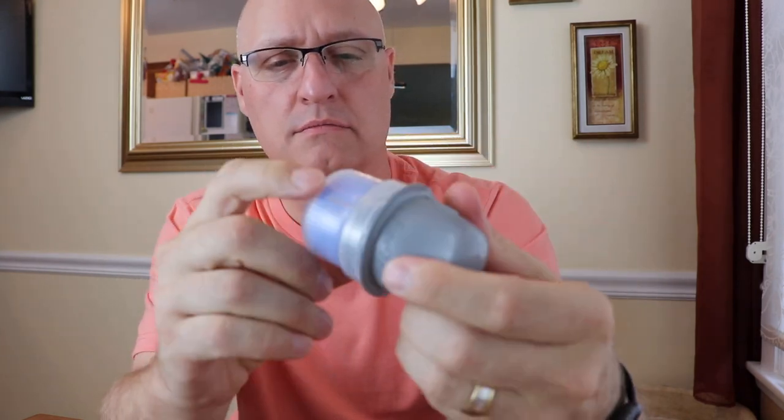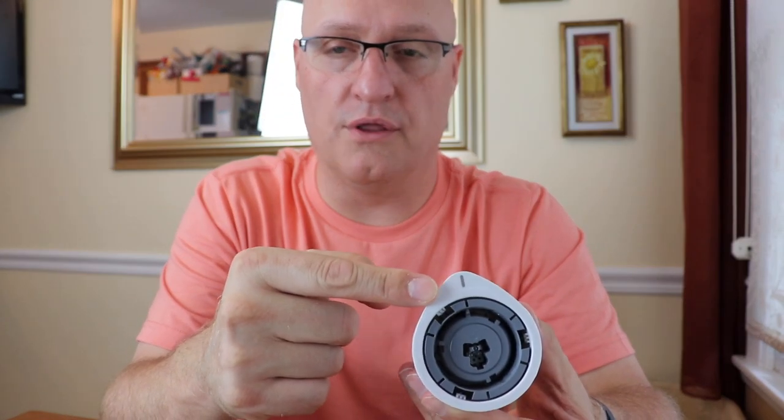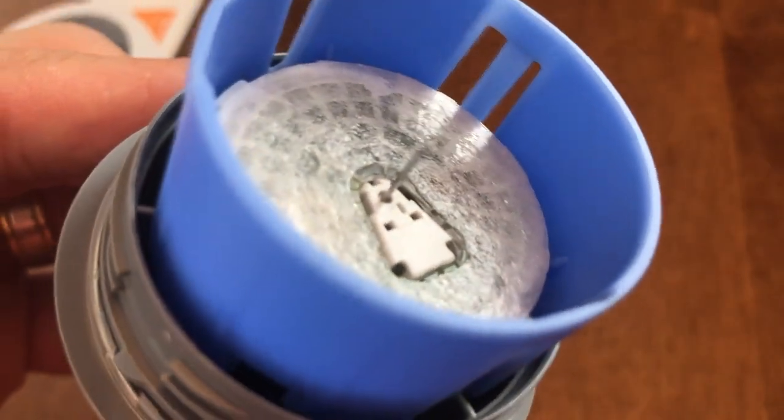I'm just going to screw this back in and put that to the side while I show you the new sensor portion. Now we're going to join these two together — it's really simple. There are two lines: a line on the applicator and a line on the actual filament needle itself. Before you do anything, you want to line those up. Once you've done that, just push down. And now you've engaged the system — that center component is right there along with the needle.